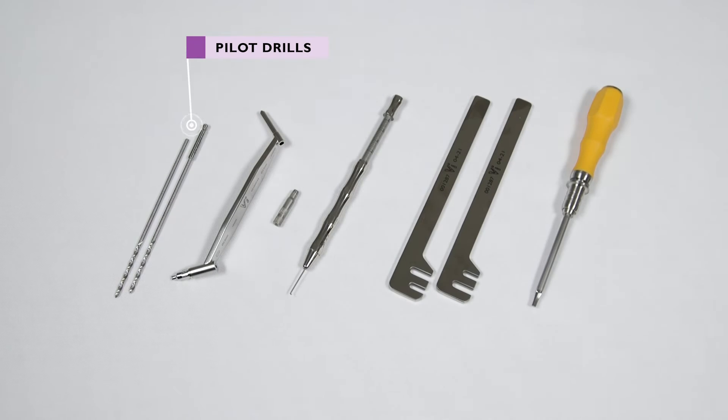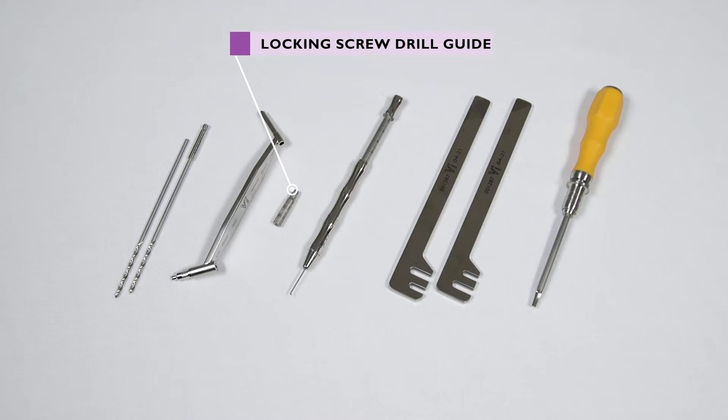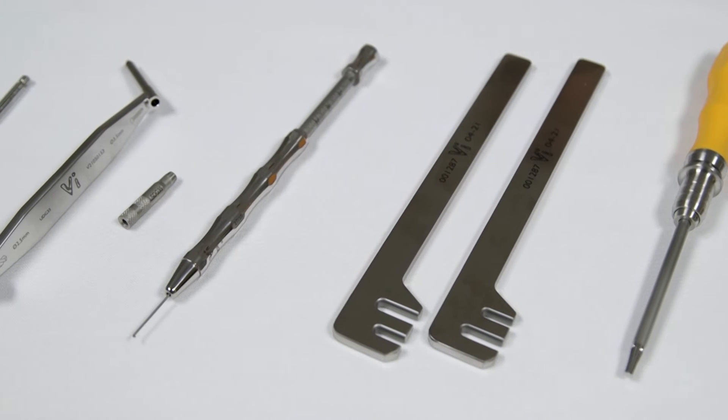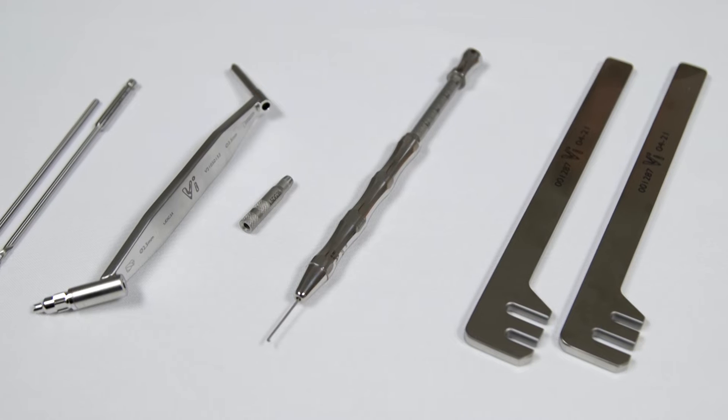Required equipment includes: a pilot drill, a universal drill guide, a locking screw drill guide, a depth gauge, bending levers, and a screwdriver. Other videos in this series have described the use of the universal drill guide, the depth gauge, and the bending levers.